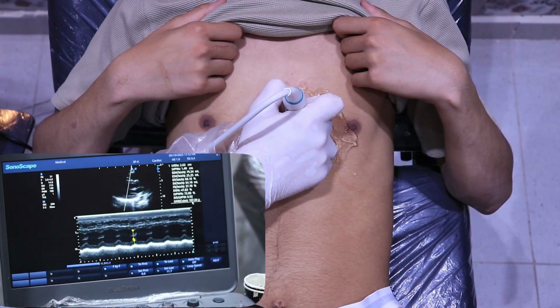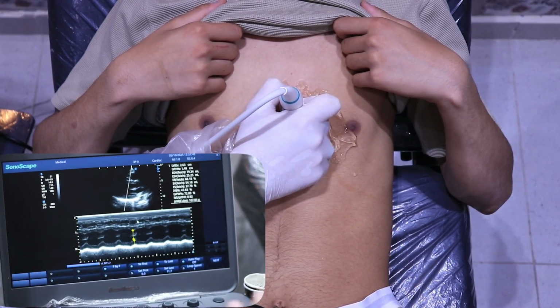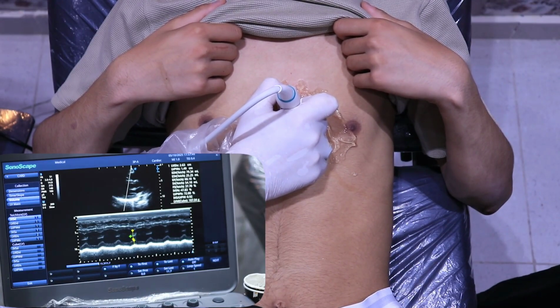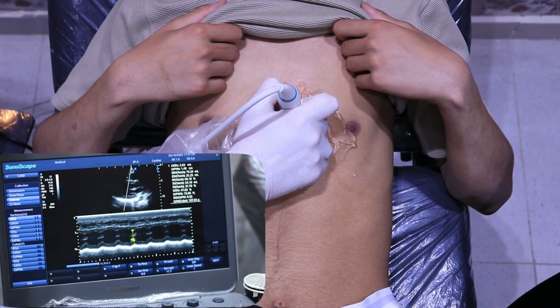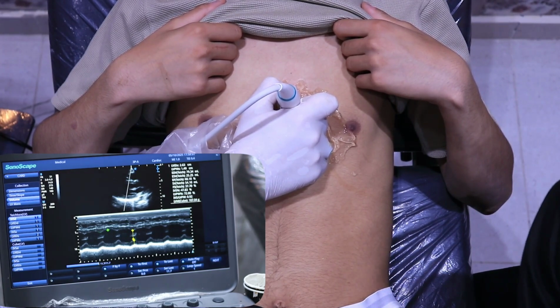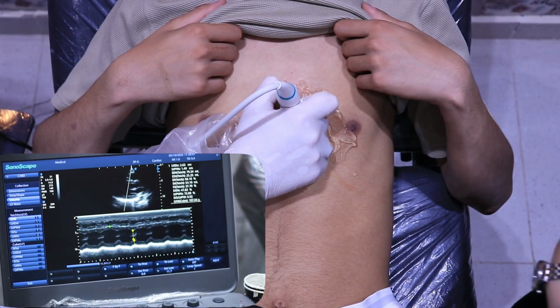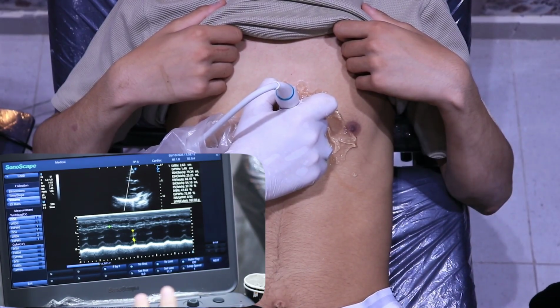في اي سؤال هنا بالنسبه للبيت فولز؟ طبعا the numbers، اي لخبطه في النمبرز هتطلع لي completely different parameters. نعم. الدكتور بنقيس على الميد على اكتر لاين كونتينوس عشان هو ده اللاين بتاع المصل وبيبقى لازم. This is during diastole. Diastole is the widest area of the muscle. يعني ممكن نقيسها هنا تاني نفس القصة، نبدأ تاني نقيسها. هنقيسها على ايه؟ على البيت دي. المهم ان انت تقيس the same beat. Okay, so this is the beat here.